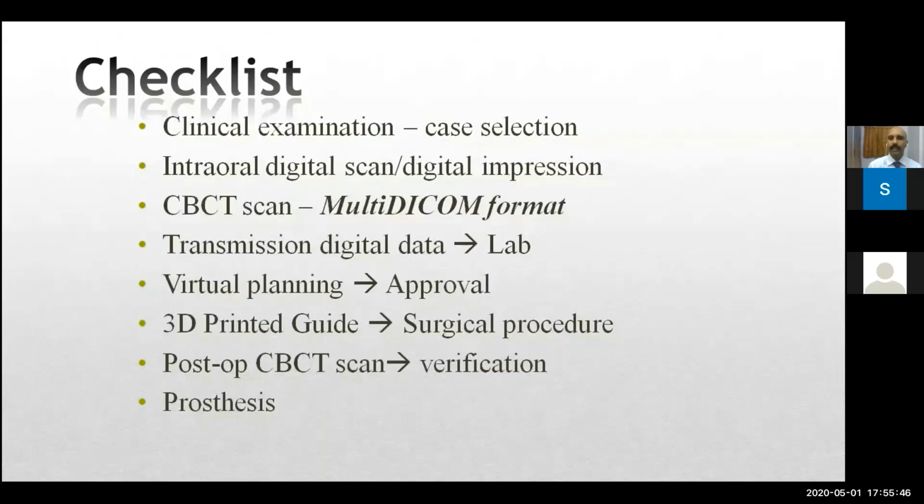But this is not a very hard and fast rule for every case. Some modifications will be there in particular cases. Those will be better explained when you have those particular cases, and if you would like to discuss it with us, you can send them to us and then we can do it. And also we'll do those detailed ones in our future webinars, wherein Dr. Swapnil can take a few particular cases and demonstrate. But this is a brief overview that we have tried to incorporate today.